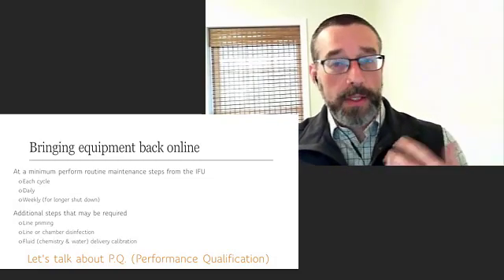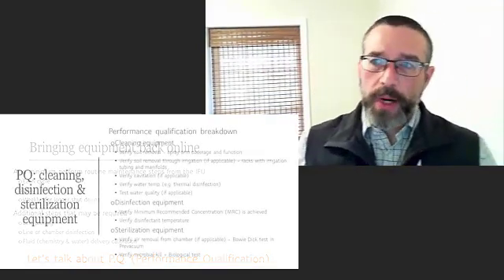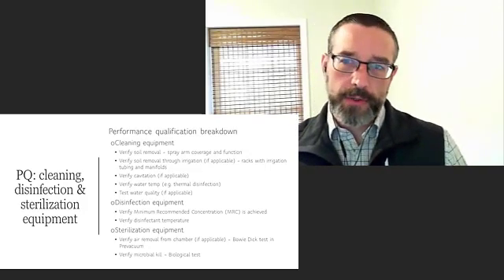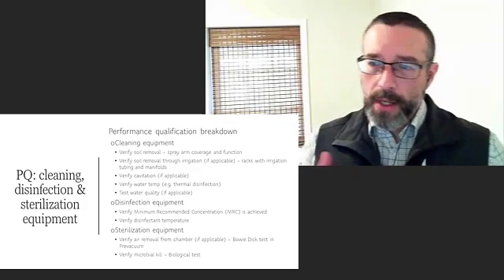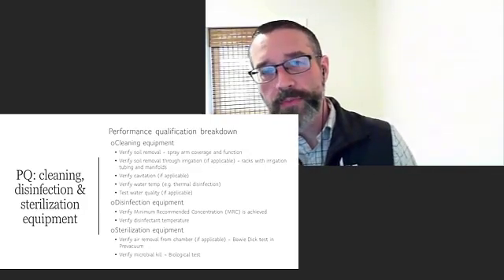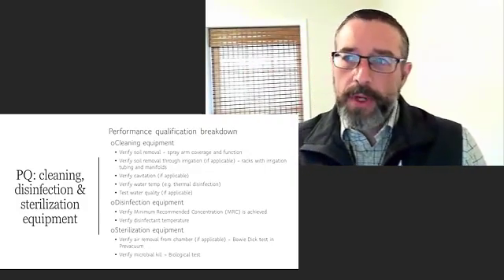And that's something that, depending on the length of your shutdown, you may need to perform. We're going to break PQ, our performance qualification, up into three sections, really. I'm going to talk cleaning equipment, then we're going to go for disinfection equipment, and then we're going to talk about sterilization. So, of course, what is our performance? What do we expect out of cleaning equipment?